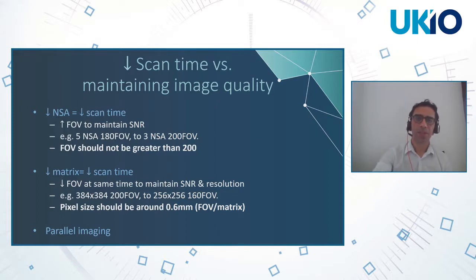Parallel imaging is where the placement and sensitivities of the receiver coils are used to assist spatial localization of the MRI signal. Having this additional information about the coils allows reduction in the number of phase encoding steps during image acquisition and a consequent reduction in imaging time.